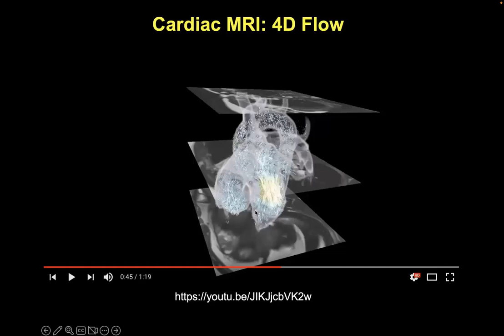Do you think there's a future for MRI guided surgery? Yes, absolutely. I invested a lot of my life into that. And you can see things under MRI guidance that you just can't under CT or X-ray, right?